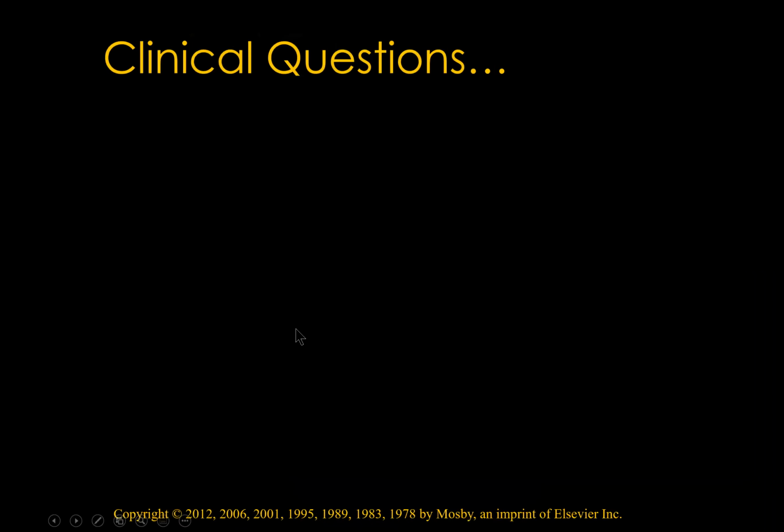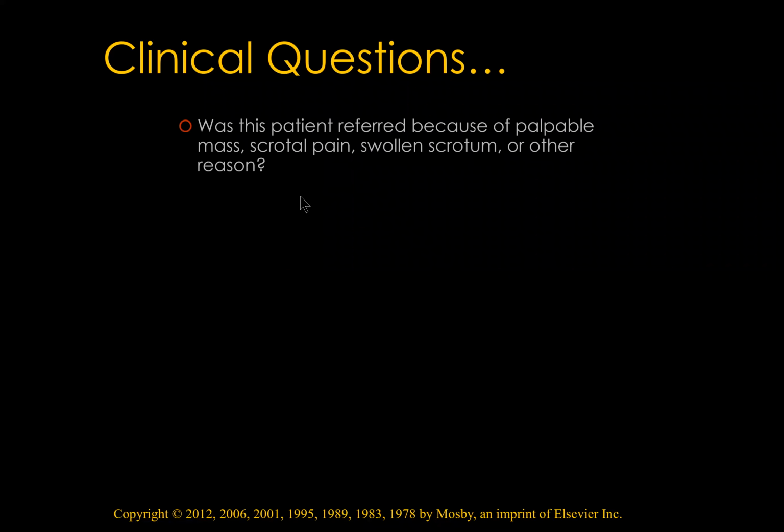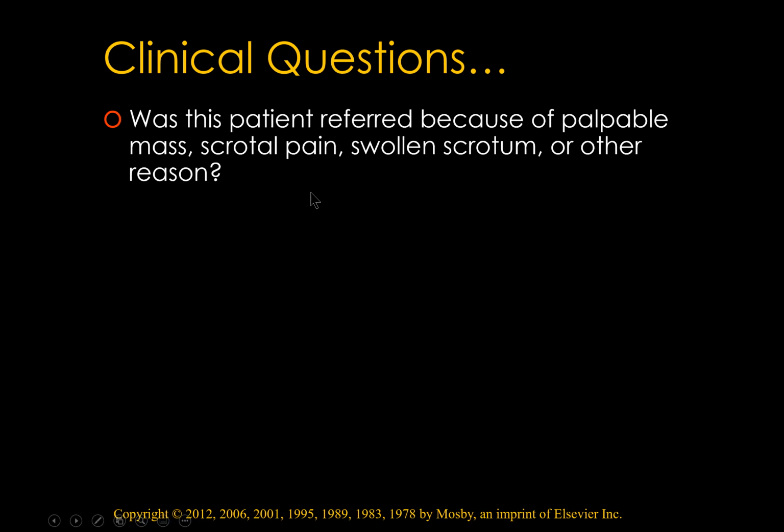Before scanning the patient, it is important to determine the clinical findings. Why was the patient referred? Is it due to the palpable mass? So you have to know why the patient is referred. Is it due to the palpable mass, scrotal pain, swelling, or another reason?